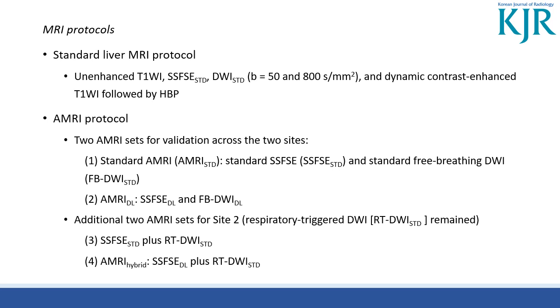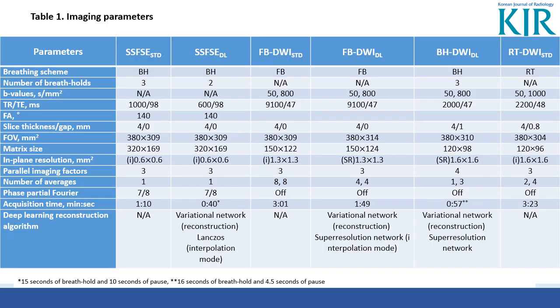At Site 2, since respiratory triggered DWI remained part of the routine MRI, we additionally analyzed two more AMRI sets. One combined standard SSFSE with respiratory triggered DWI, while the other, AMRI hybrid, combined DL-SSFSE plus standard RT-DWI. This table shows the detailed MRI parameters.